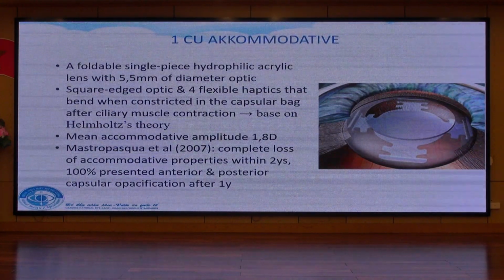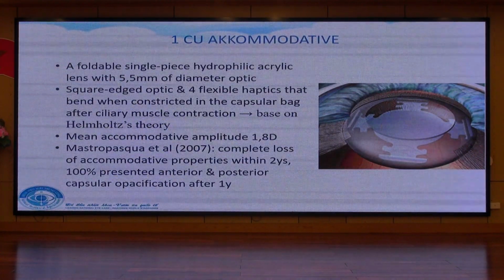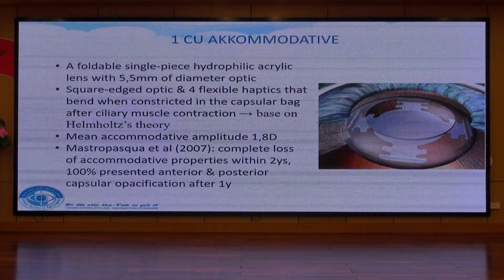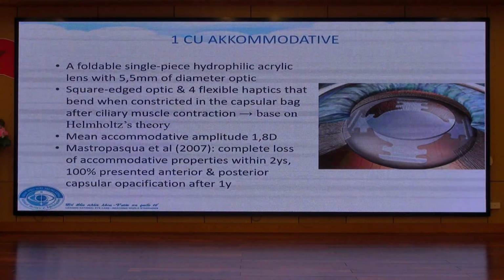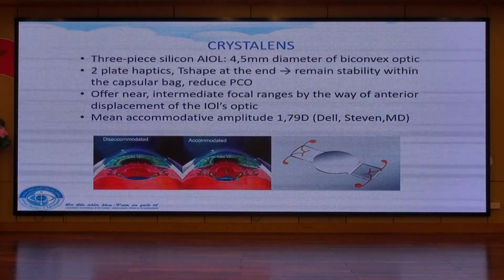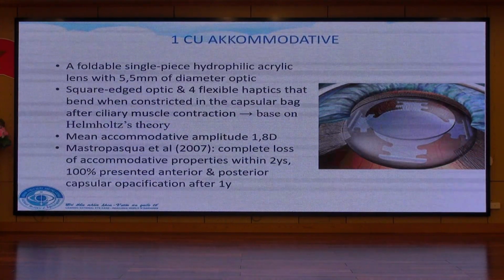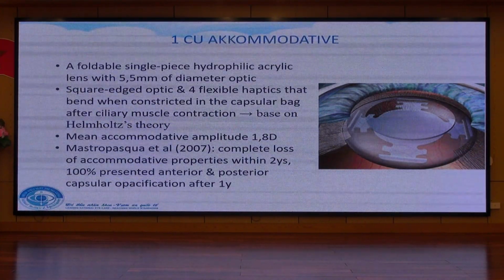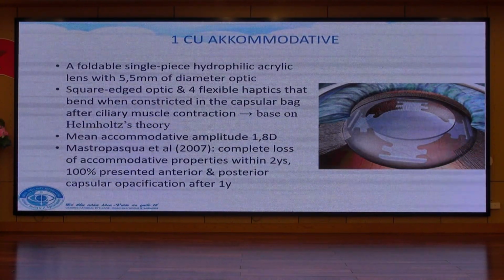The second one is the 1CU accommodative IOL. This is a foldable single-piece hydrophilic acrylic lens with a 5.5 millimeter diameter optic, a square edge optic, and four flexible haptics that bend when contracted in the capsular bag after ciliary muscle contraction, based on Helmholtz theory.